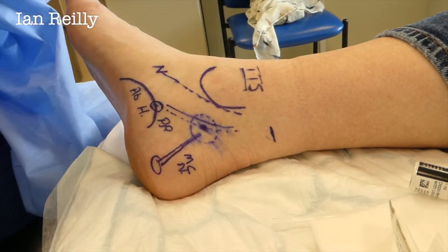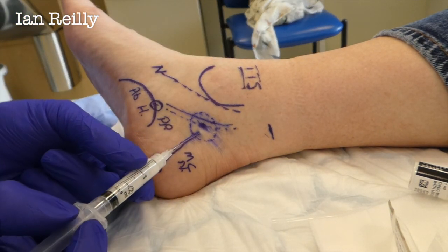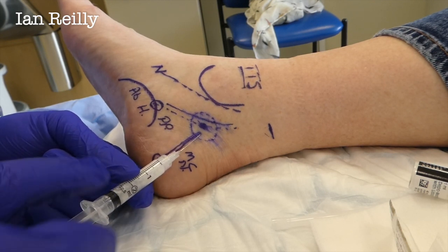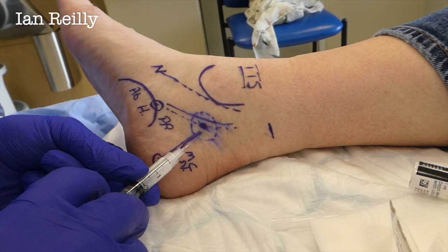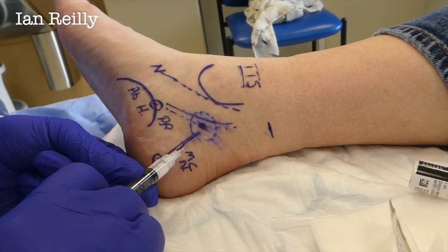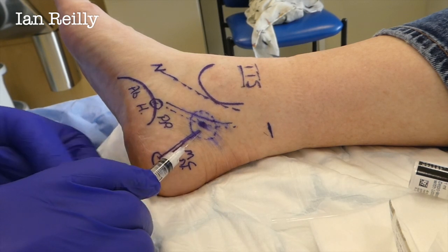Just slush that up and get the air out of it. There'll be a little bit of a scratch and then a bit of a sting. So there's the arch — we're going to come behind that. Three, two, one — scratch. I'm behind the artery. Any stinging in that area as it's going in? Yeah. I'm not looking to find the nerve with the needle, but if we do get it, it tells me I'm in the right area. You saw that I aspirated — I'll recheck to make sure there's no flashback in the syringe, because flashbacks are not good.